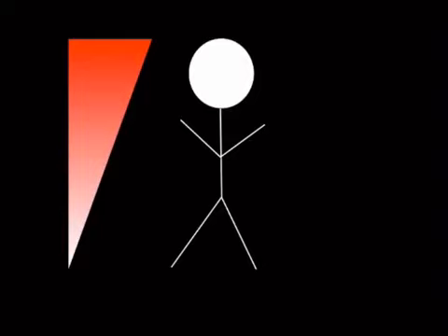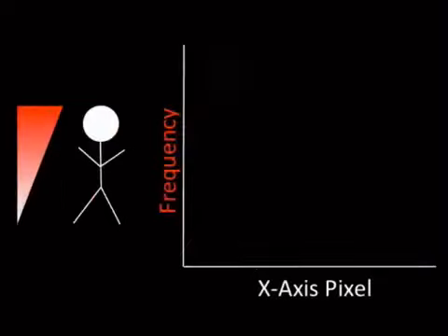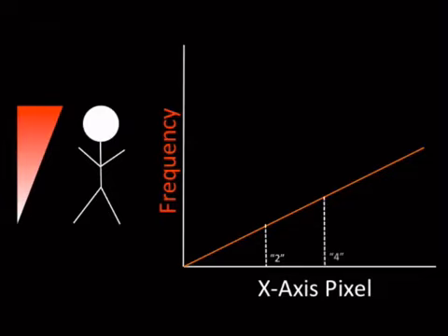As you may remember, part of MRI is localizing the signal to a particular voxel or point in space. And this is done with the application of a gradient, frequency encoding. So a gradient is placed, and that lets you say that something is at one spot versus another spot.